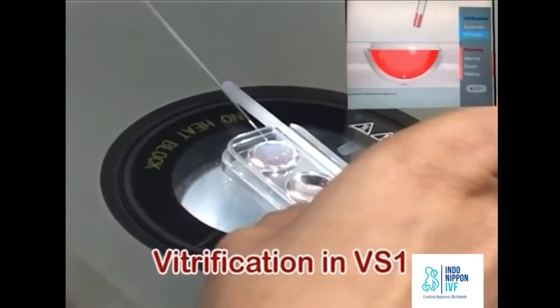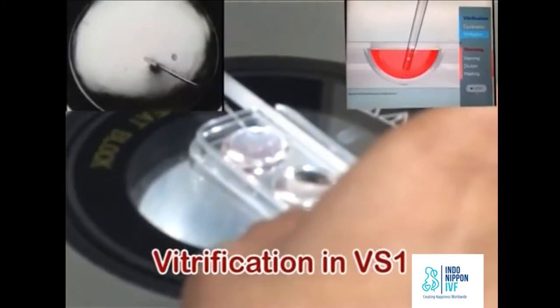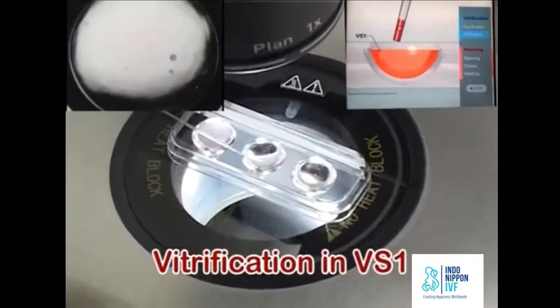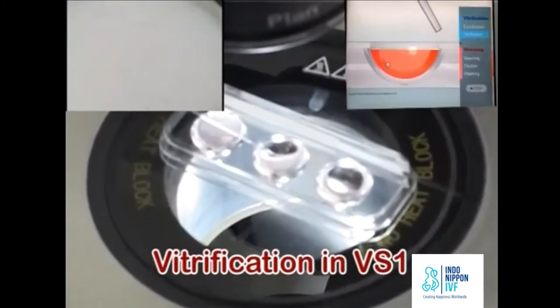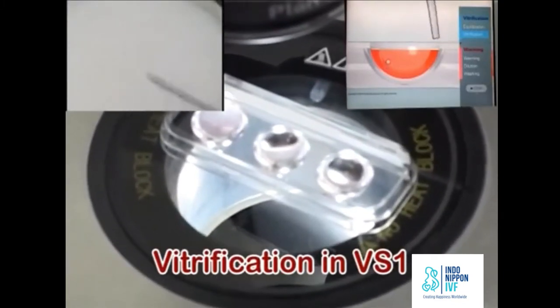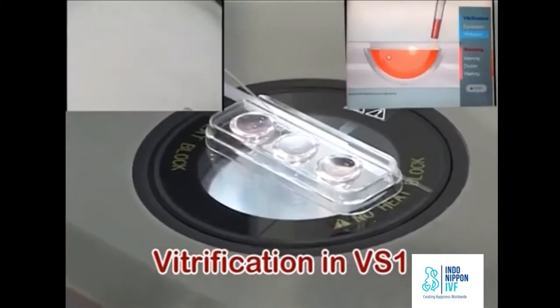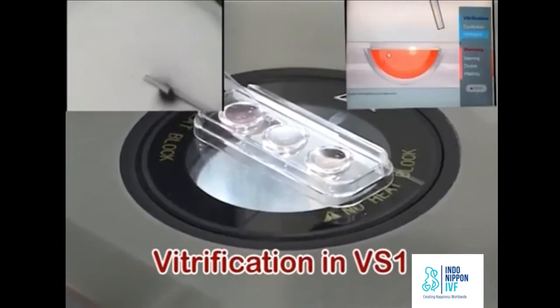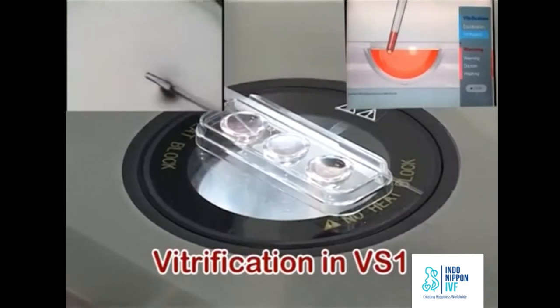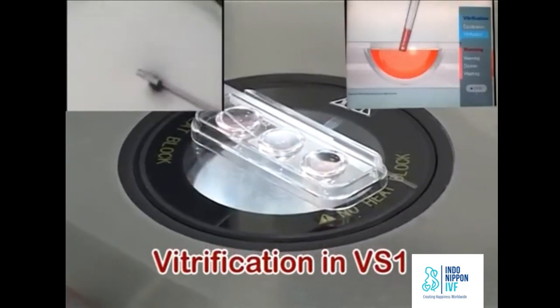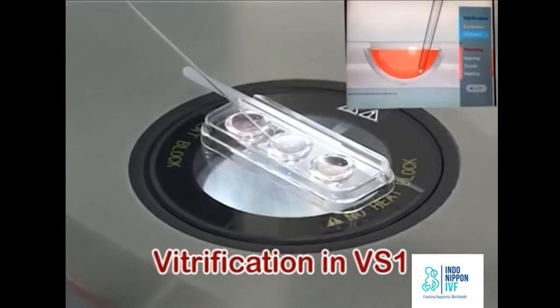Aspirate the oocyte with ES at the tip of the pipette. Transfer the oocyte at the middle depth of VS-1. Discard the remaining ES outside the well and aspirate fresh VS-1 from the edge of the wall. Oocyte floats immediately to the surface of VS-1. Aspirate oocyte at the tip of the pipette and transfer it again to the bottom of VS-1. The oocyte floats slowly to the middle depth and stops.